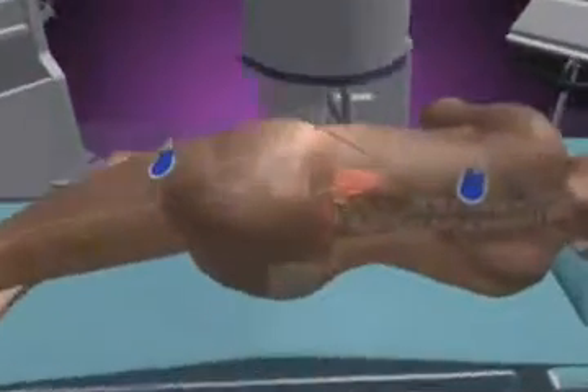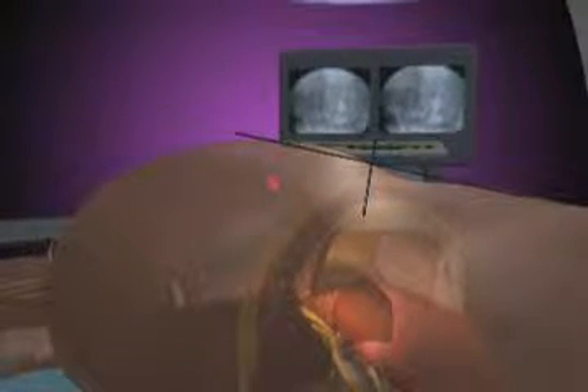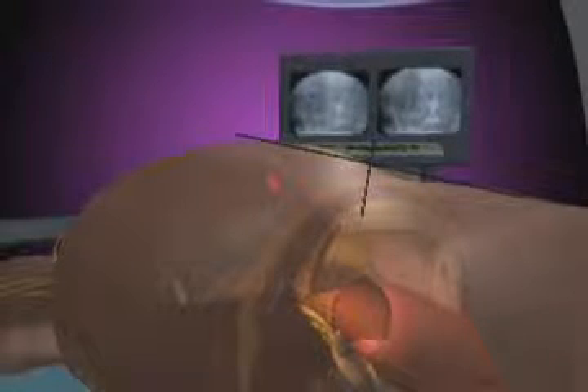The surgery is performed with the patient positioned on the side. An x-ray is taken of the spine to show the location of the operative disc space. The skin is marked at this location to indicate the site of the side incision.